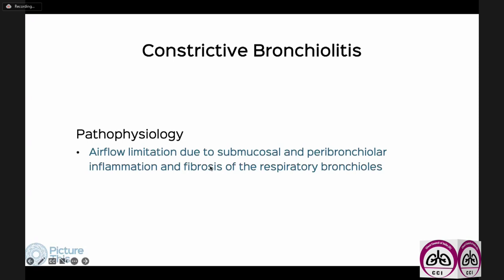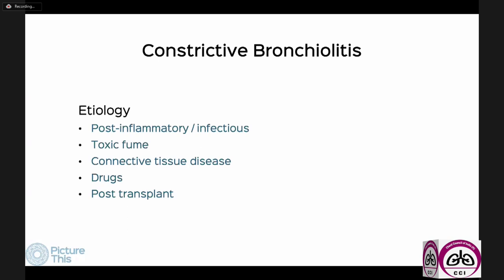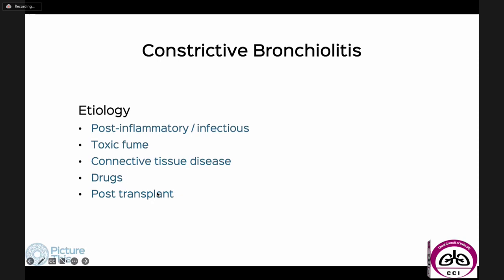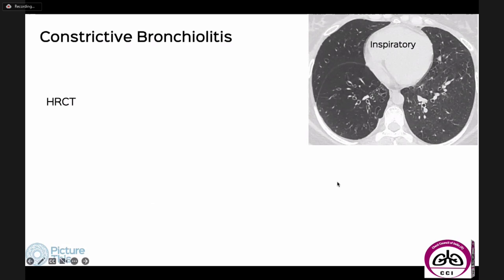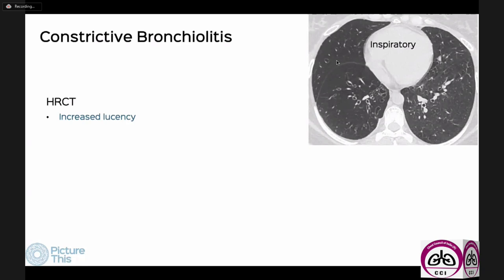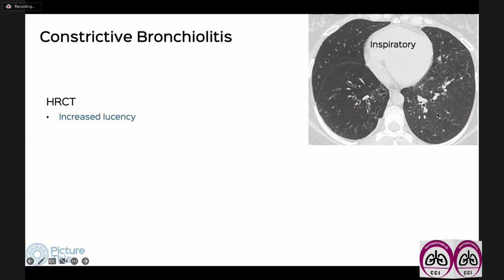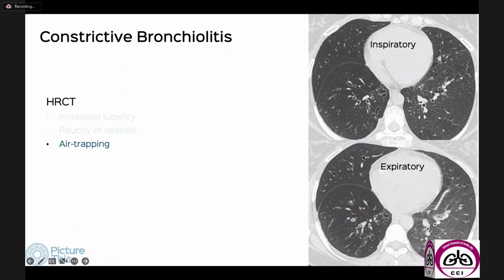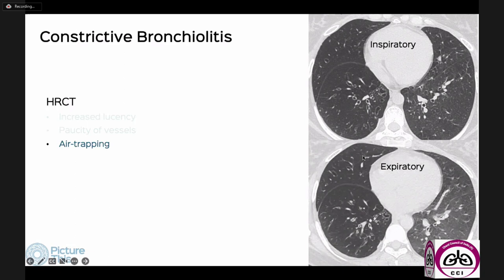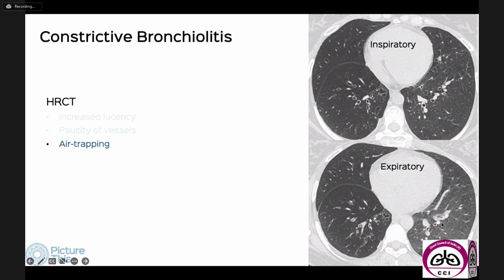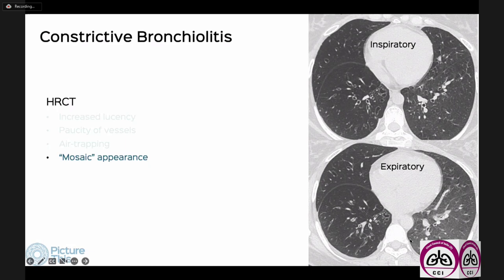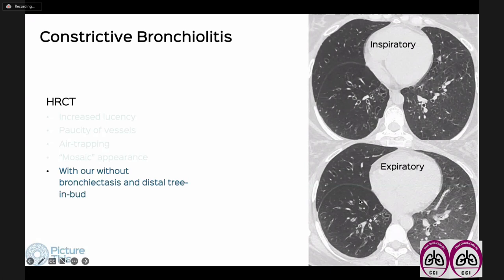Constrictive bronchiolitis is when there has been some insult to the terminal bronchiole, resulting in airflow limitation due to fibrosis of the terminal and respiratory bronchioles. On CT we need a paired inspiratory-expiratory scan to make the diagnosis. We see areas of increased lucency, paucity of vessels, and on the inspiratory-expiratory pair you can see air trapping — compare the abnormal side to the normal, where on expiration there is normally an increasing gradient of whiteness. This gives rise to the mosaic appearance, and you may or may not have bronchiectasis.